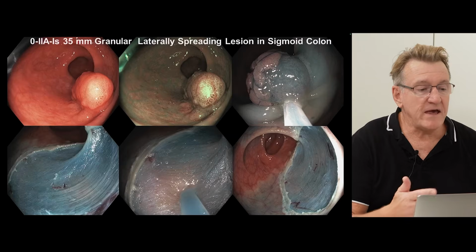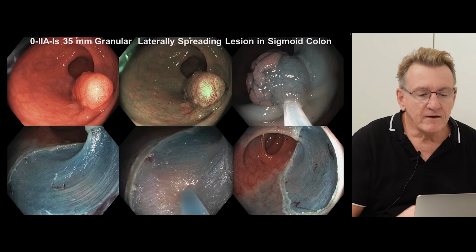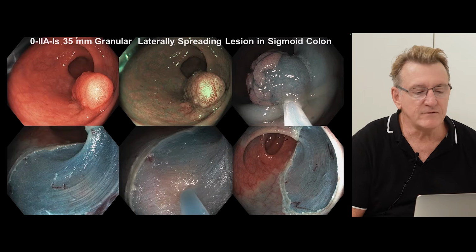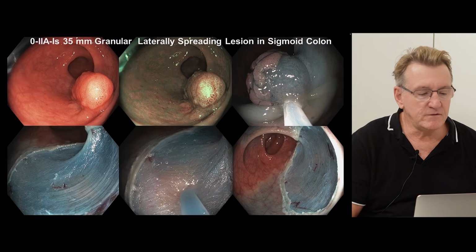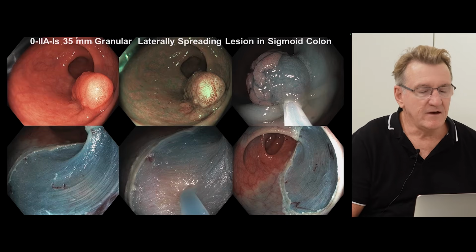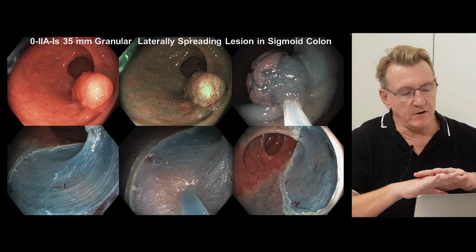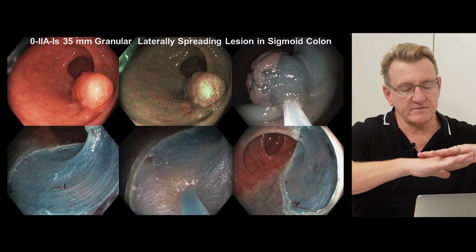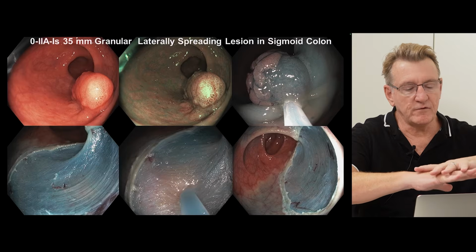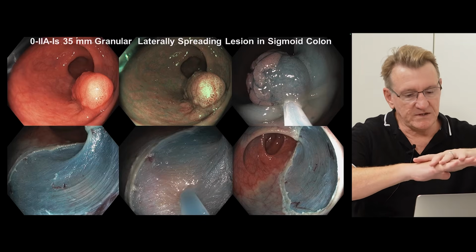So what's a normal defect? Well, this example in front of us is a granular lesion, 2A plus 1S, with a bit of lateral extension. After it's been removed, you can see a beautiful image down here on the left with a wide submucosal defect. The submucosa is a bland blue mat of intersecting loose areolar connective tissue, which is a potential space.